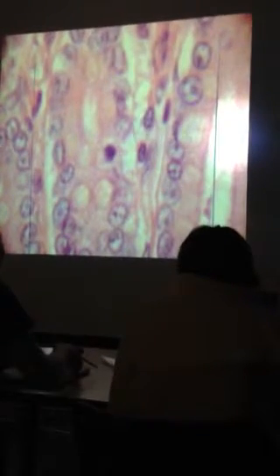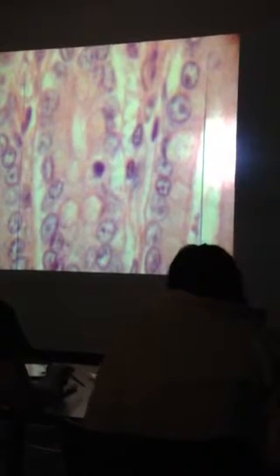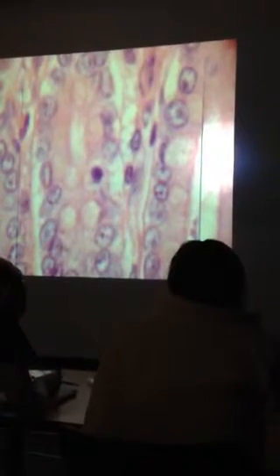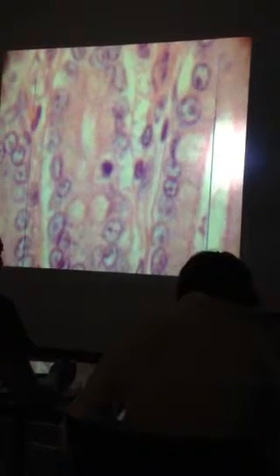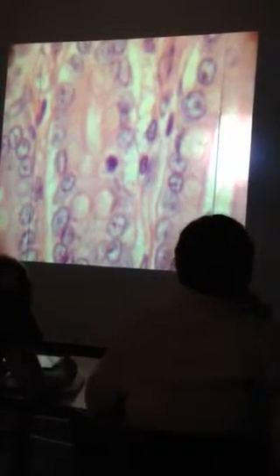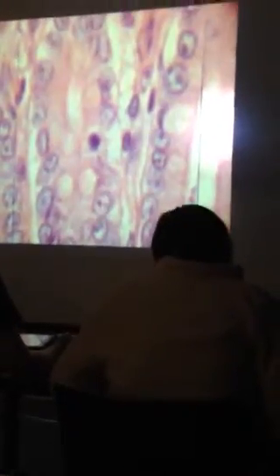What are the wheel and spoke ones? The epithelial cells, I'm not really sure at this point. It looks like these have goblet cells, so this is probably not the stomach, this is probably part of the intestines. Because don't forget, what do you call the intestinal glands? What's another name for intestinal glands? The crypts of Lieberkühn, right? So these are probably from down in the glands. Because remember, the enteroendocrine cells are not going to be up on the villi, they're going to be down in the intestinal glands.